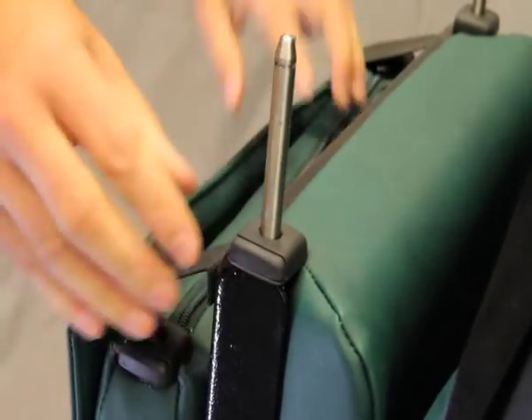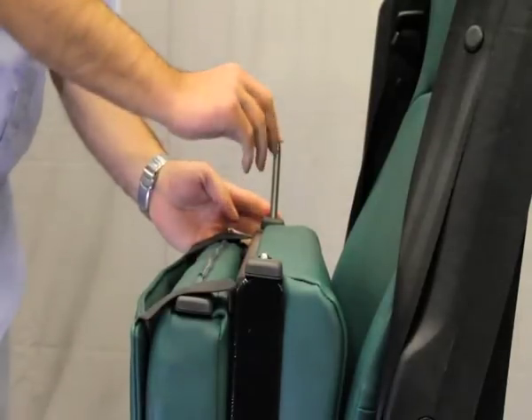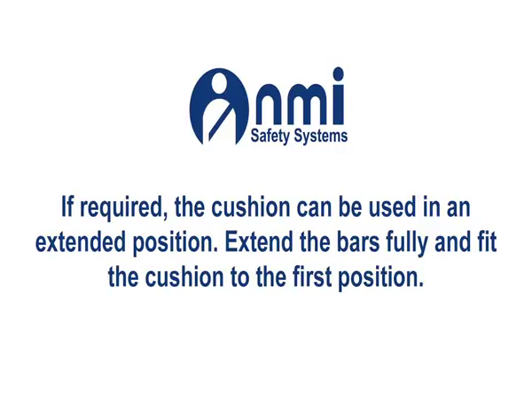To retract the stalks, squeeze and hold each catch and push down. If required, the cushion can be used in an extended position. Extend the bars fully and fit the cushion to the first position.